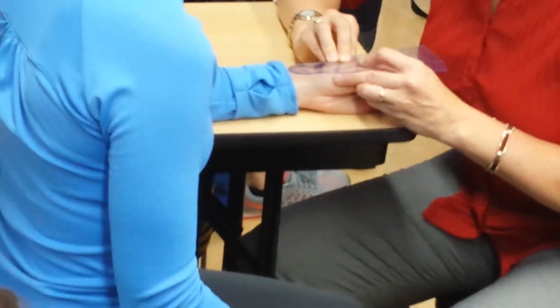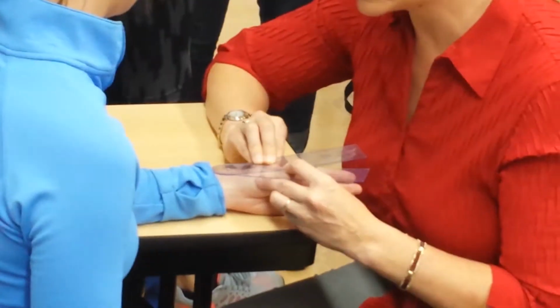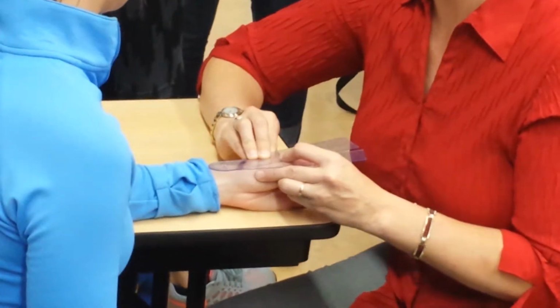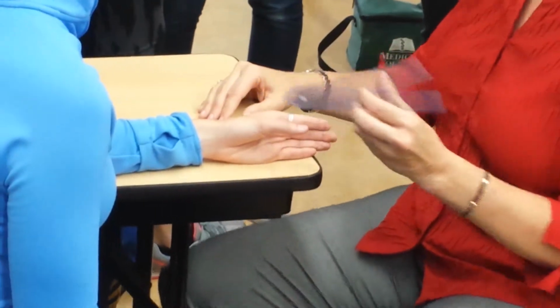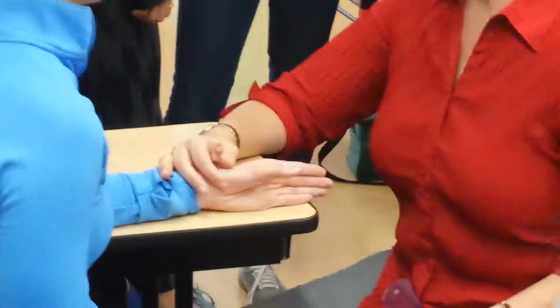did you really start at 10? No, you started at 20. So I got 10 degrees of motion of abduction. Okay? So that's how you measure CMC abduction.